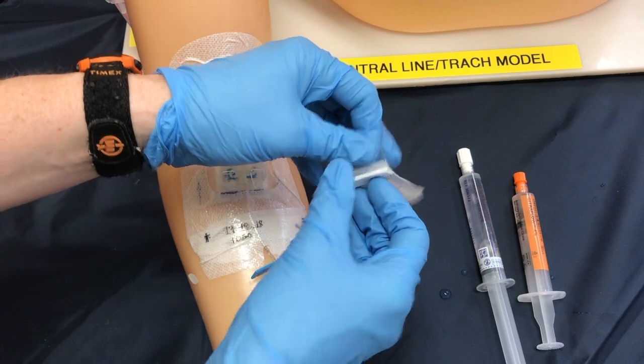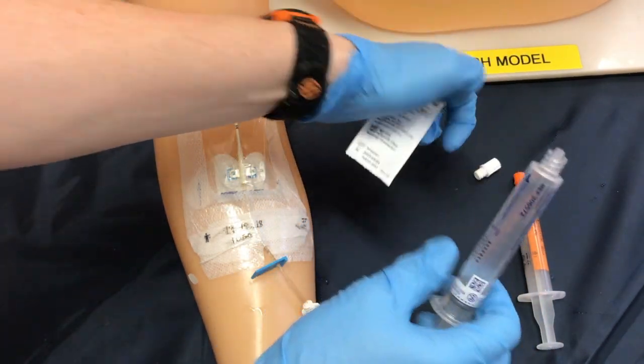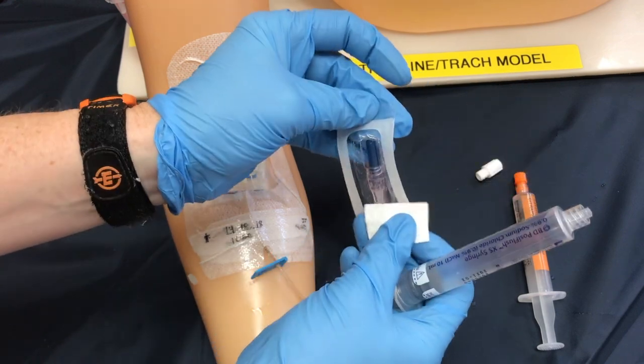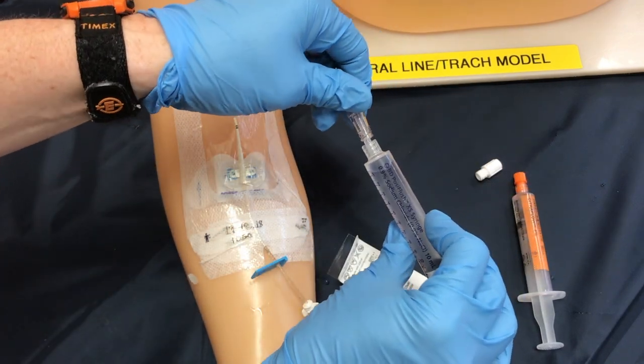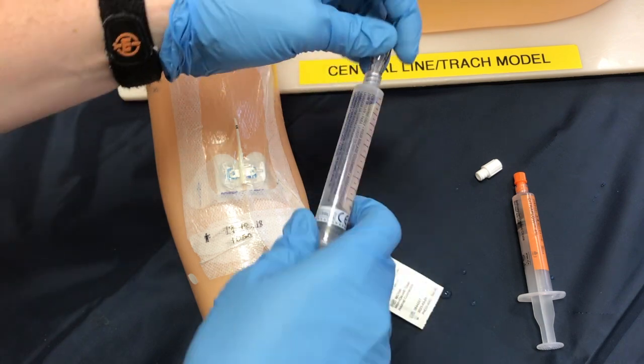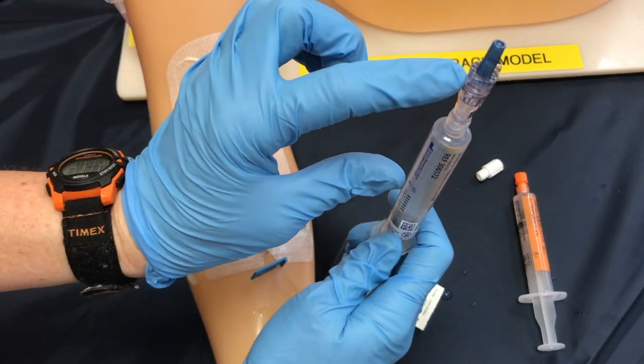The next step is to prepare my cap. We're getting the saline ready and we're going to prime the cap prior to changing it — this removes any air bubbles. So from sterile tip to sterile tip I can attach the two and gently push forward my saline until it is primed.